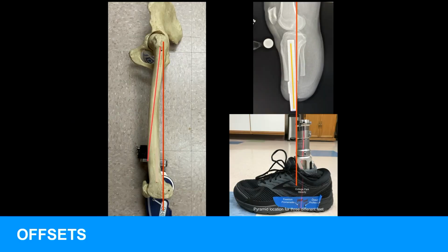Here's a femur on top of a 3R80 knee, and that's in an anatomical position. You can see the anterior bowing of the femur. If we're going to amputate, that connection is going to be anterior to the weight line. Offsets are important. In the transtibial picture here, you can see that the tibia is anterior to our normal AP weight-bearing line, and you can see where the connector of the foot is. We need probably a 20 millimeter posterior offset for this patient.